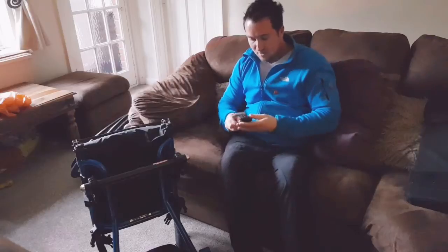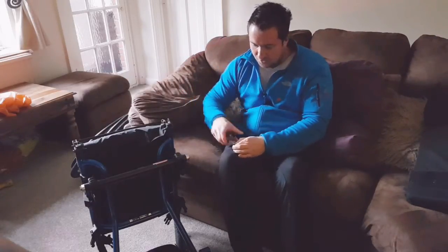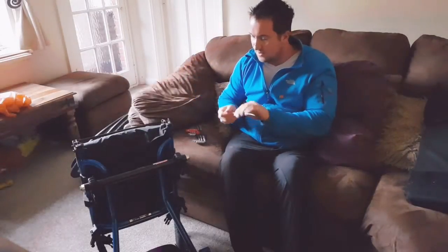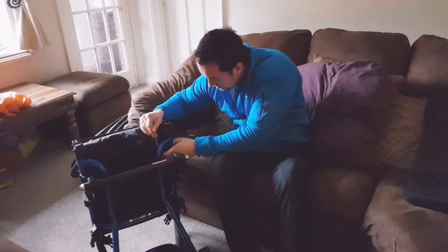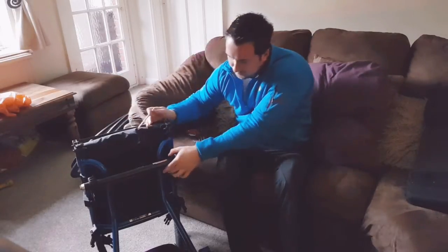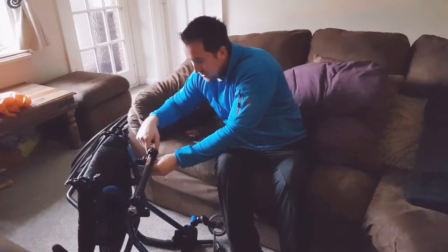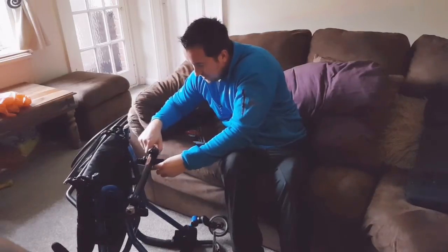I'll get the chair into a position where I can easily reach all the bolts and get the right allen key out. These aren't the best allen keys — I do wish I had the ones with a handle on the end, which are much easier to use. Perhaps that'll be something I'll go and purchase in the near future. This is quite a pig to do, so I might skip part of the video depending on how difficult it is and how much time it takes.